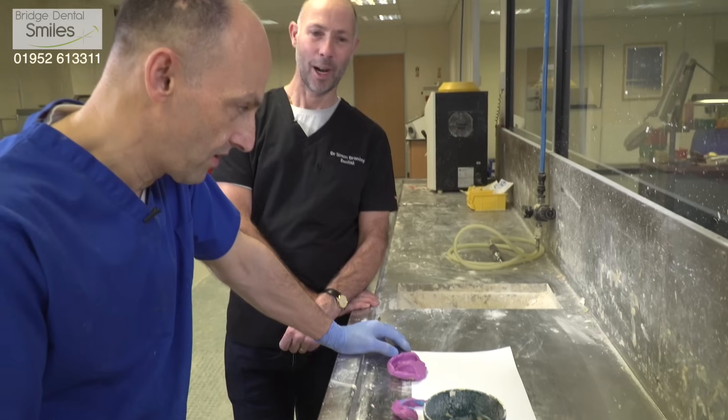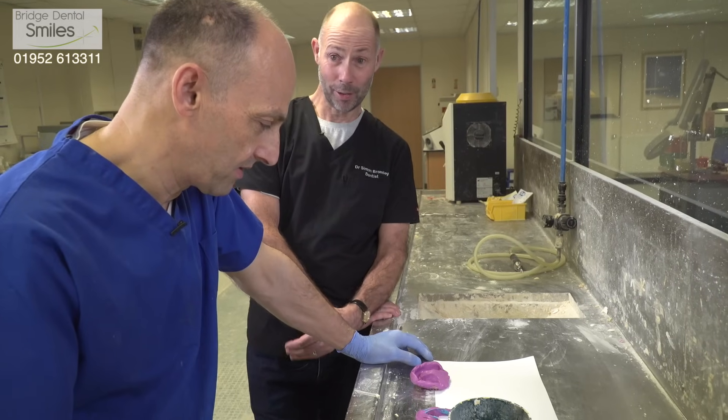Hi Simon, lovely to see you, thanks for coming over. Okay Stuart, this is the first part of the denture process — can you just talk us through what you're doing?